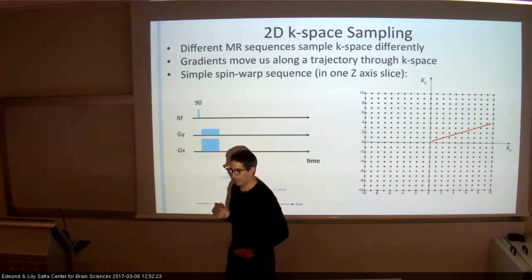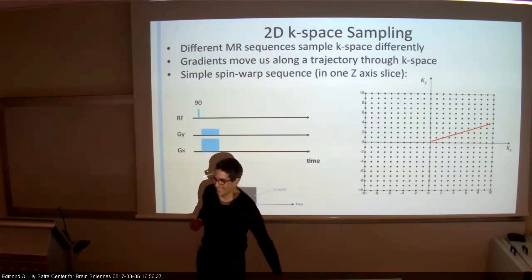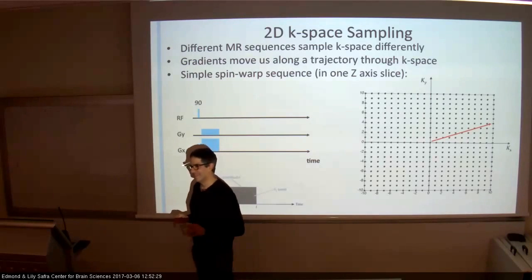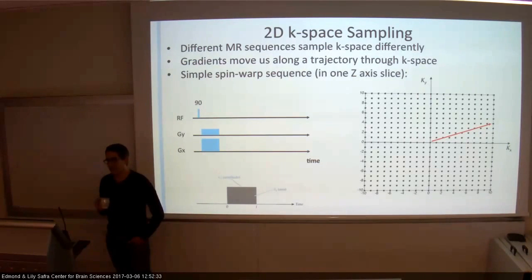Okay. So we're going to have this number of slices. Every slice I choose will have its own K-space. Yes.